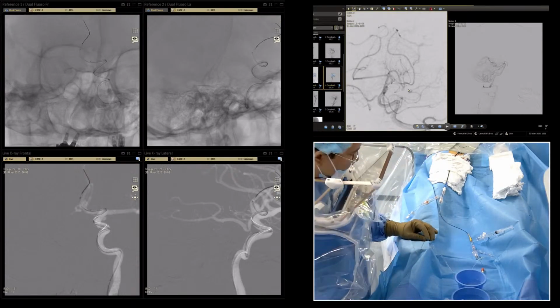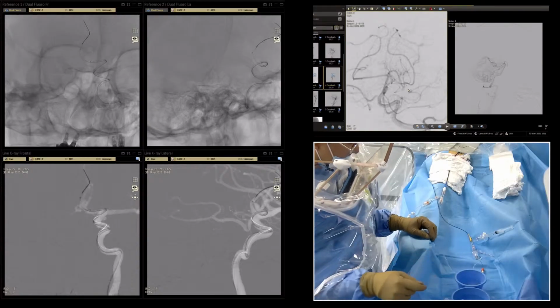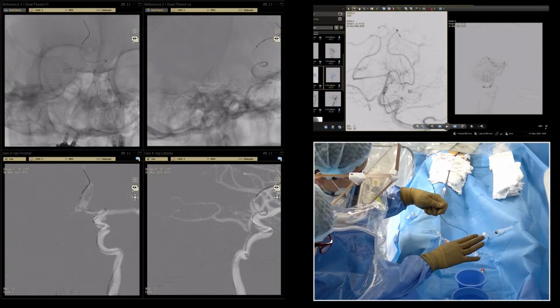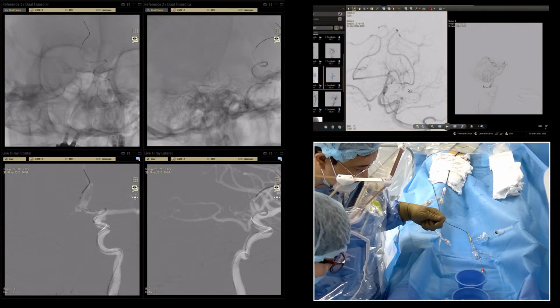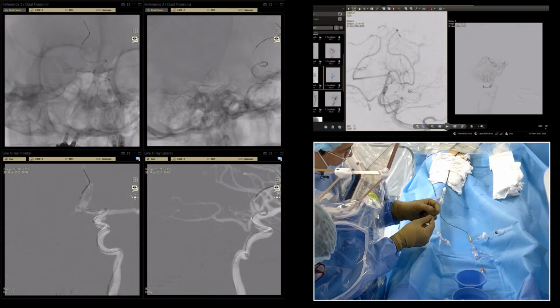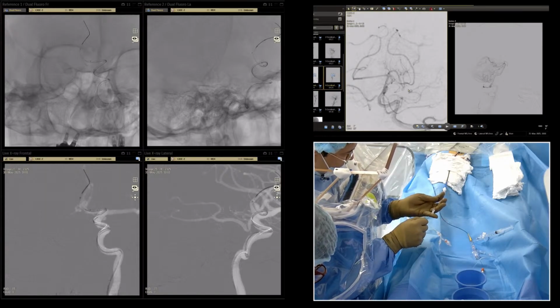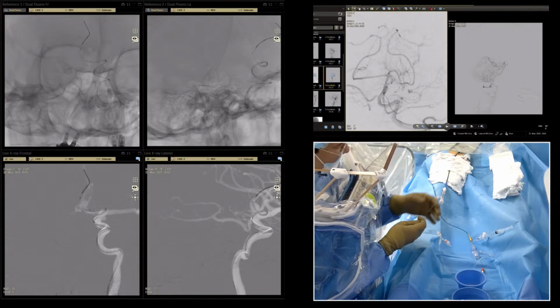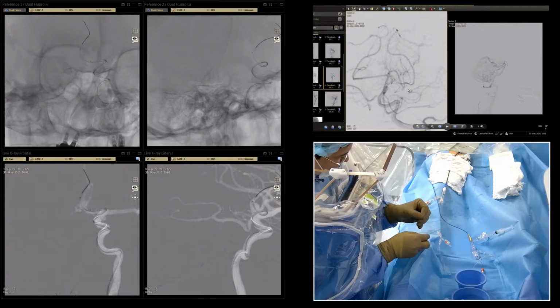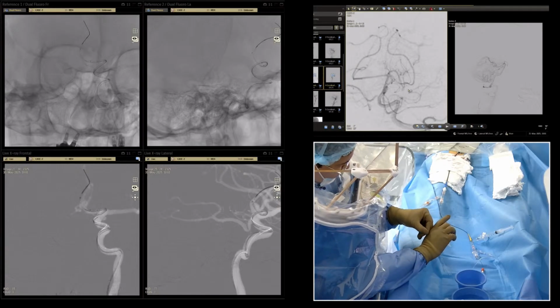Let's shape it. Then it's important how long it will keep the shape. It's quite angulated. It's interesting. Yes, we gave a little bit more angulation.